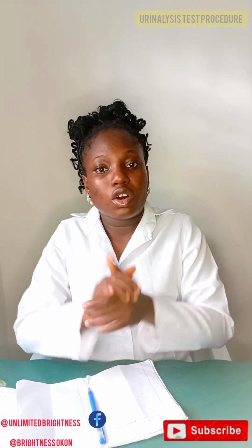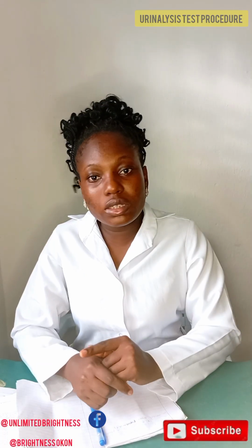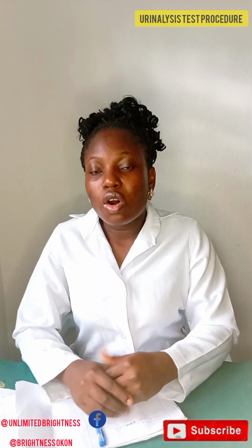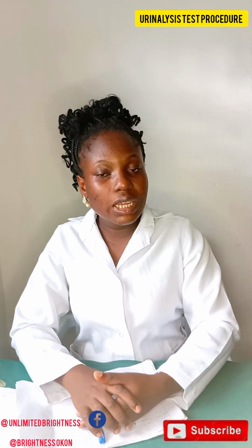We have other abnormal constituents in urine, which are protein, glucose, blood, nitrite, ketone, urobilinogen, bilirubin, and a whole lot more. All these things are byproducts of the body's metabolism. For instance, bilirubin is a byproduct of red blood cell metabolism.